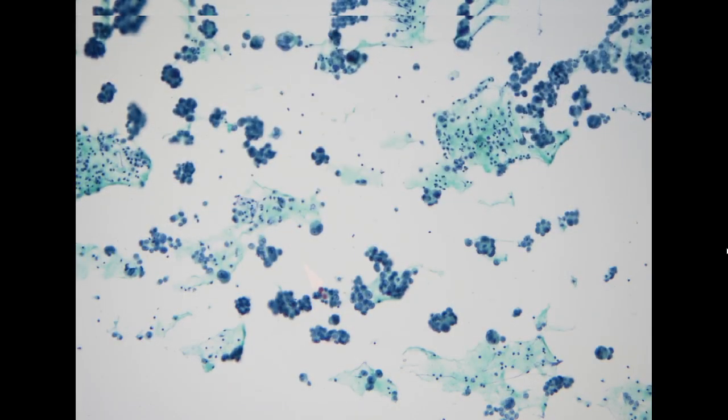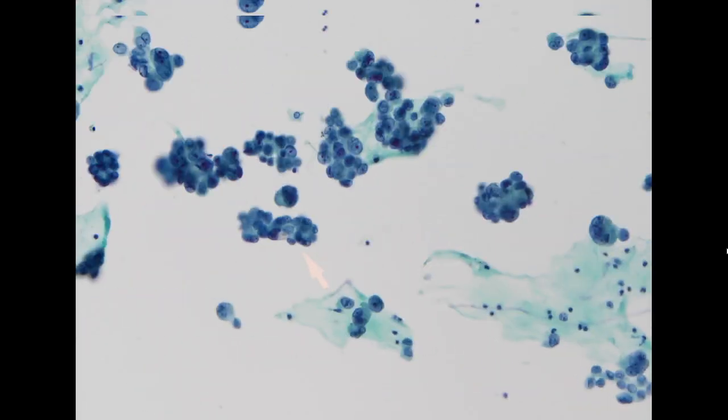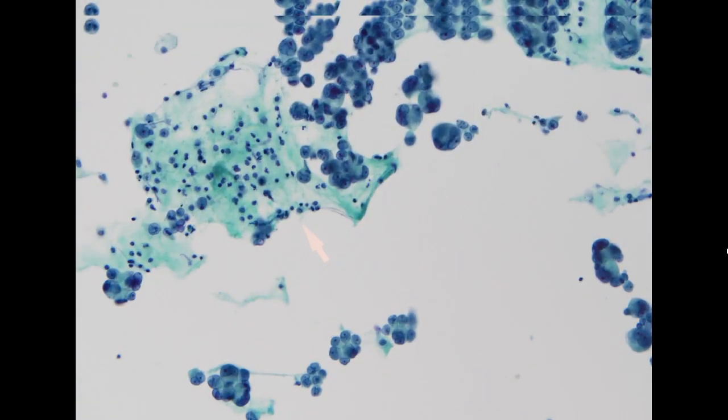The initial specimen usually looks like this. Lung cancer is most common here, and in 50% of the cases when we identify the cancer, the patient presents with advanced disease, which means with pleural effusion and cannot have surgery. They need to have systemic treatment already. So we will see this type of specimen in half of our lung cancer patients with pleural effusion. It looks like this. So this is very typical.